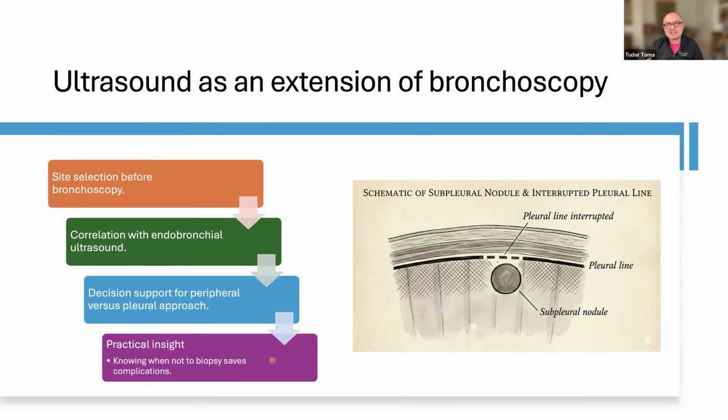From the inside of the chest, I would say that the learning is essentially related to optimizing the image at EBUS and also to understanding the technology, which is the elastographic assessment of the lymph nodes, and also perhaps the use of contrast.